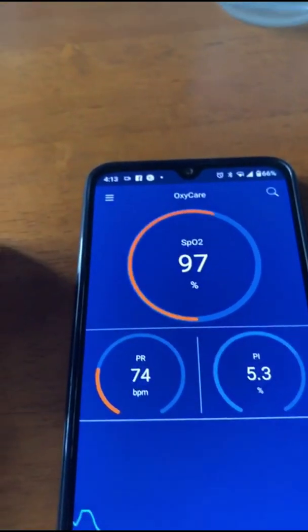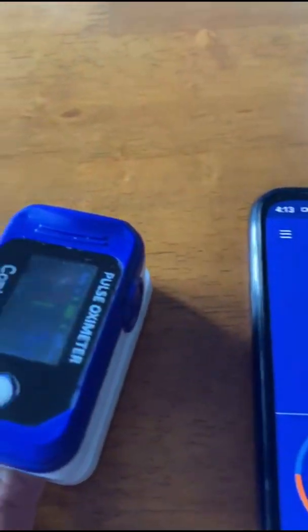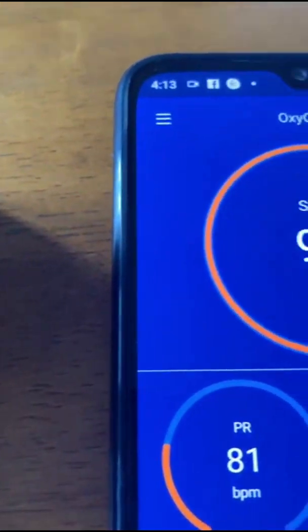However, I'm told that for elders it is the middle finger that you use. The oximeter can work standalone and doesn't need to always be paired with the phone.